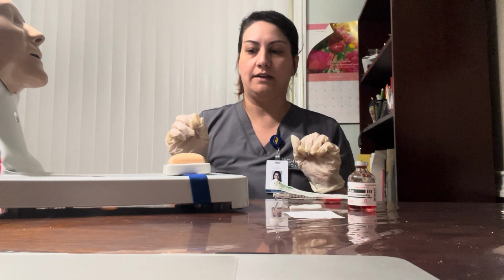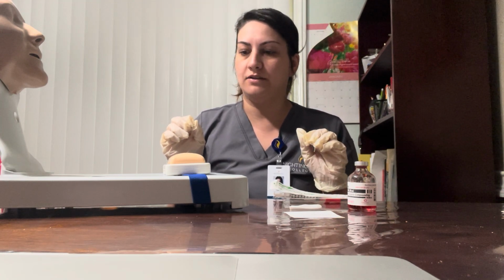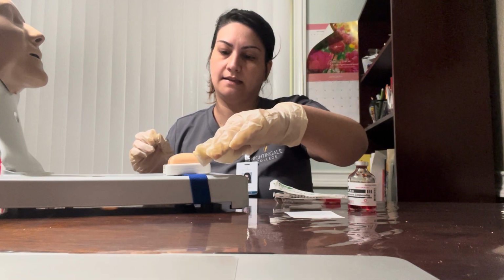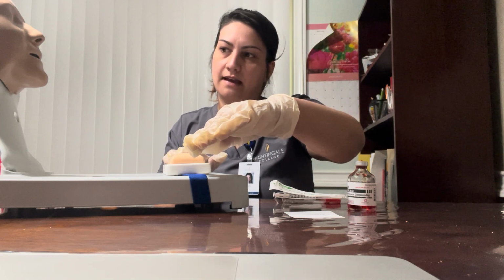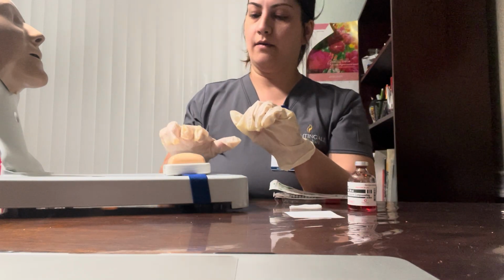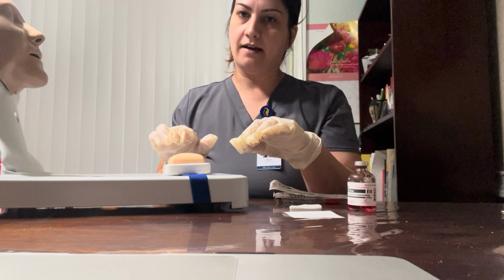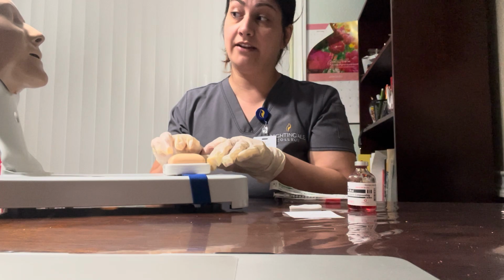Next, I'm going to locate the patient's area where I'm going to inject. So I'm going to place my 2 fingers where the appropriate wrist is, and my 2 fingers by the other side, which is where the elbow is, the antebrachial area. I will look, and I'm going to make sure that I inspect the area, no lesions, no discoloration, and I'm going to palpate to make sure that there's no tenderness. There's no tenderness. Feeling any tenderness, Miss Smith?